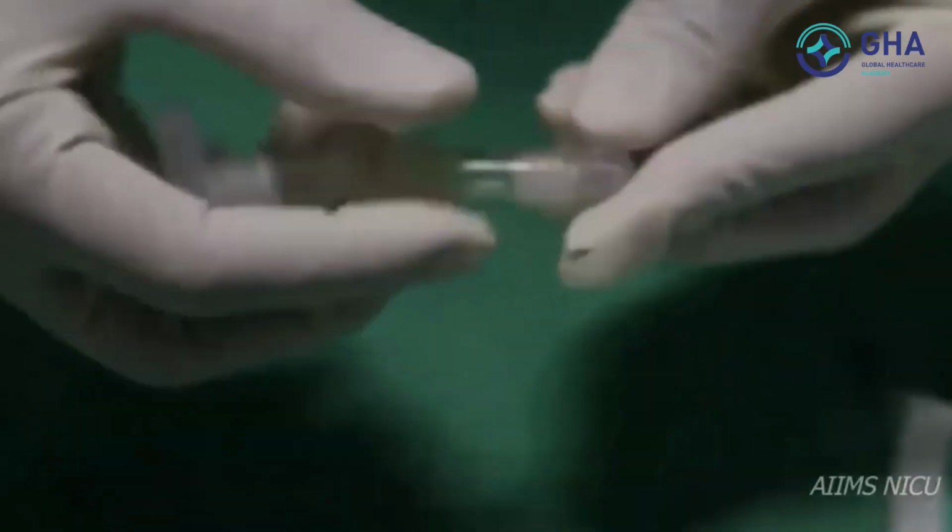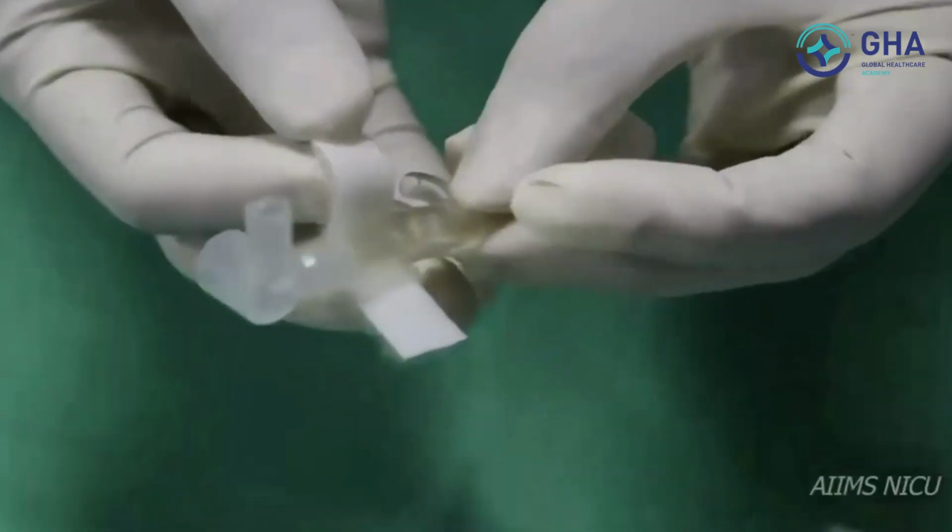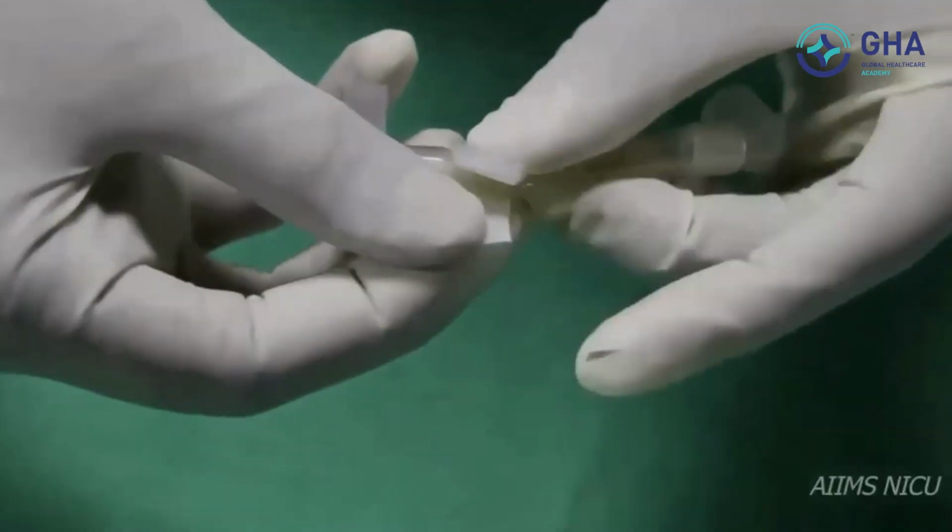Fit the soft Velcro onto the prongs on either sides of the prongs.